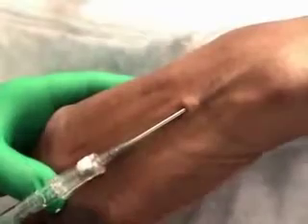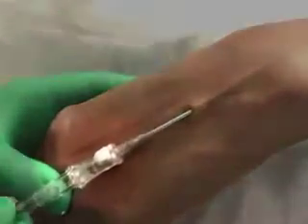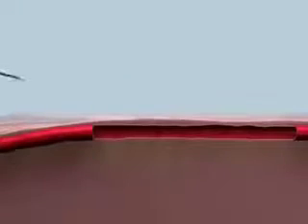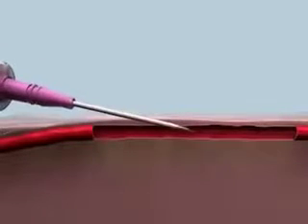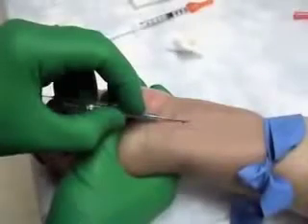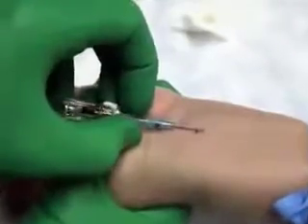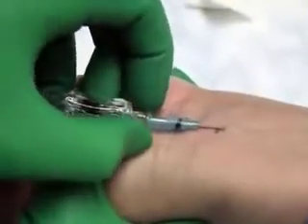When the catheter enters the vein lumen, watch for the initial flashback of blood, which will slowly fill the catheter chamber. Once the metal needle and plastic cannula are in the lumen, lower the catheter so that it is almost parallel to the skin. Hold the end of the catheter with the thumb and index finger of your dominant hand. Maintain tension on the vein and the skin, stabilize the needle, and carefully advance the catheter into the vein.